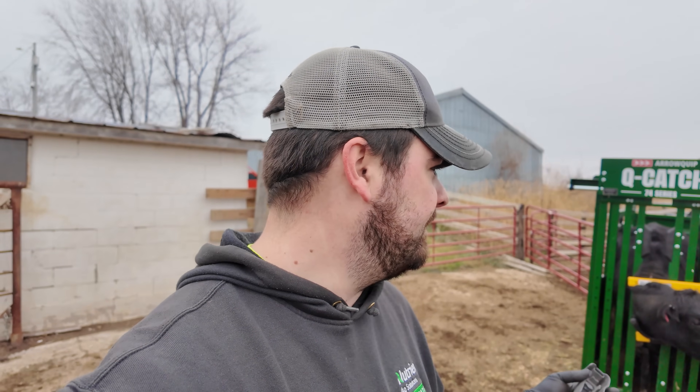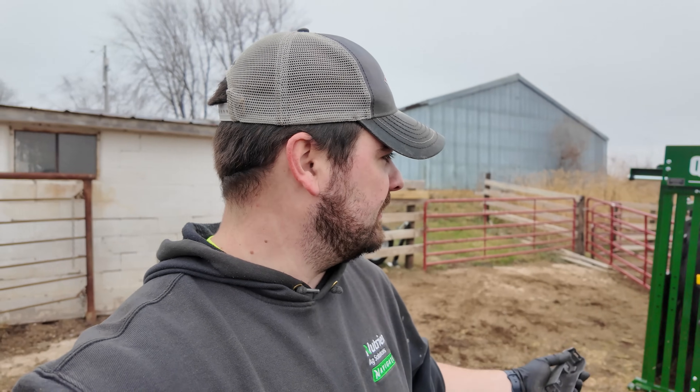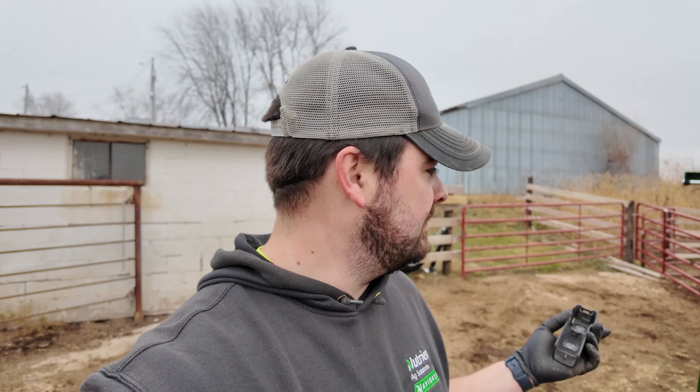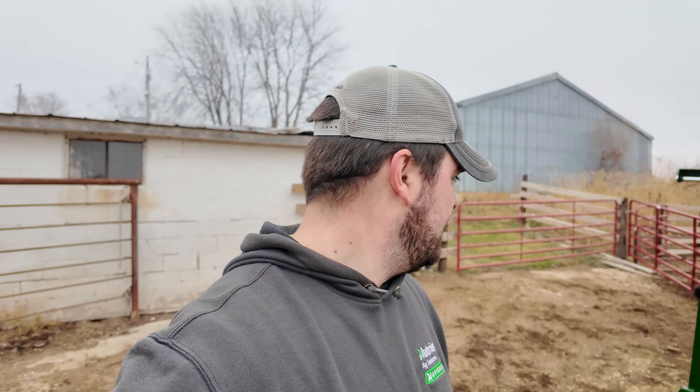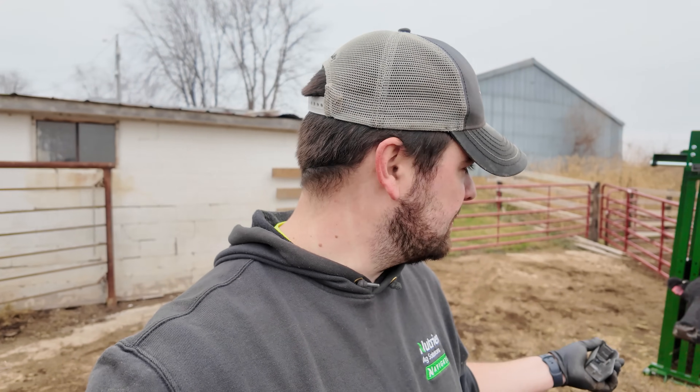So Hannah and I have the cows all penned in and we are taking blood draws out of the cows. It's pretty simple — you just hold their tail up and you stick a needle in at the base of the tail. You stick the vacuum tube onto the needle and it creates a vacuum that will suck blood out. You send it to the lab and you should have the results back within a couple weeks. We're going to go ahead and take a blood draw on number 46 first to show you guys how it's done.